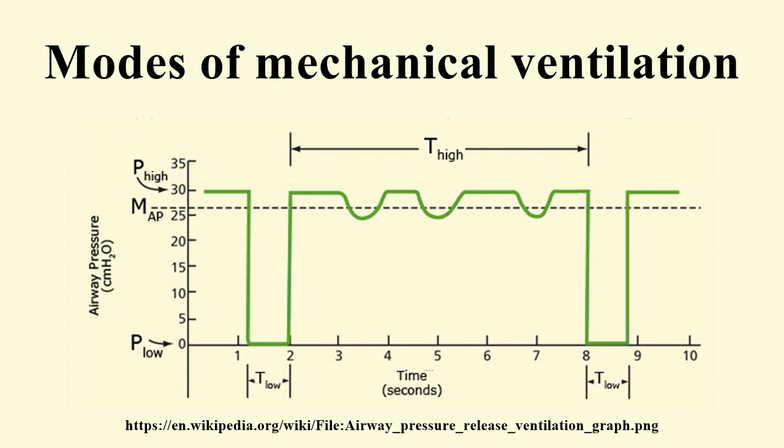There are 5 basic ventilatory patterns: VC-CMV, VC-IMV, PC-CMV, PC-IMV, and PC-CSV. The combination VC-CSV is not possible because volume control implies machine cycling, and machine cycling makes every breath mandatory, not spontaneous. A 6th pattern, TC-IMV, is possible but rare. Within each ventilatory pattern there are several variations that can be distinguished by their targeting scheme. A targeting scheme is a description of how the ventilator achieves preset targets.